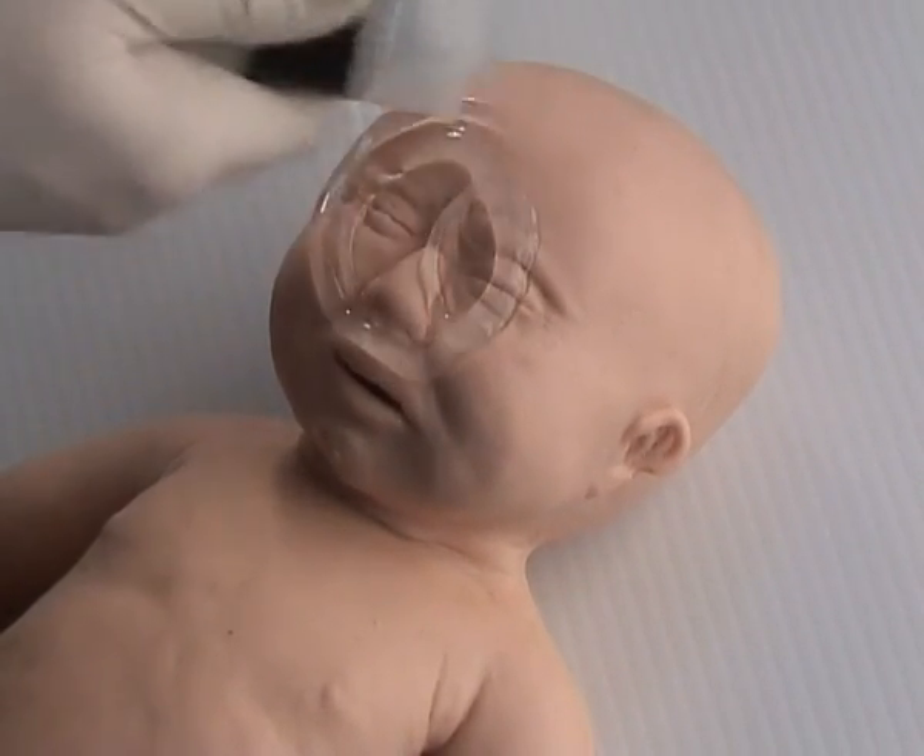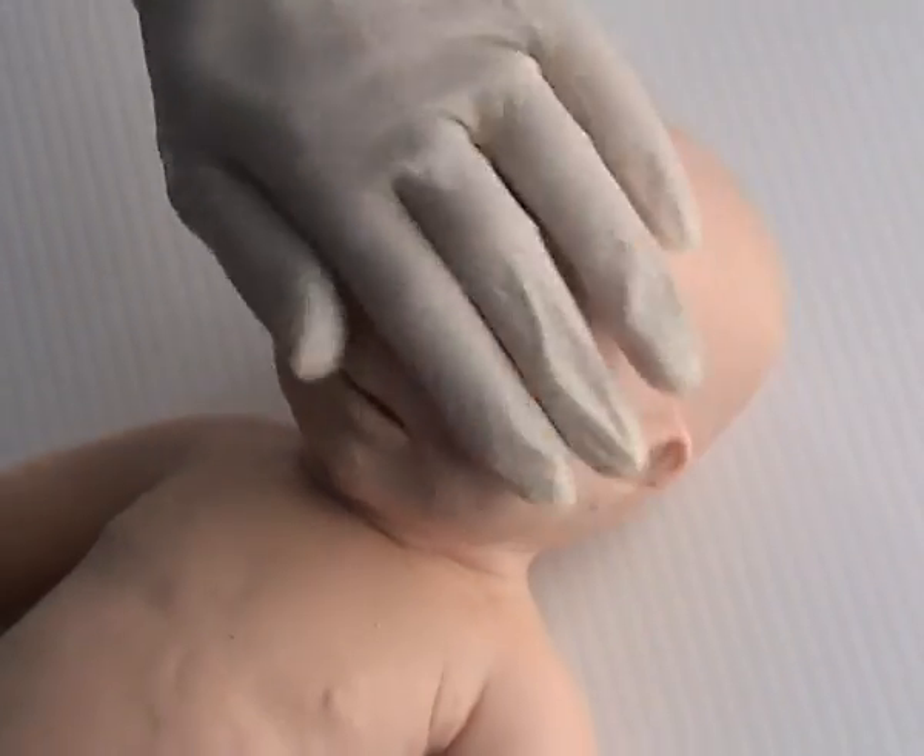Now cover Sophie with a generous quantity of lubricant from head to toe on both the back and the front.